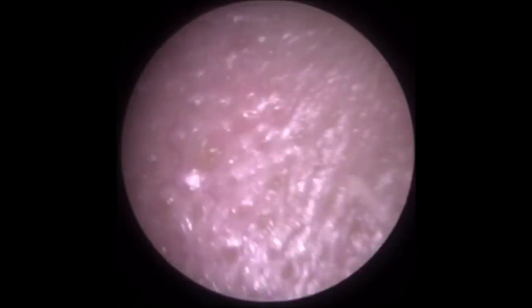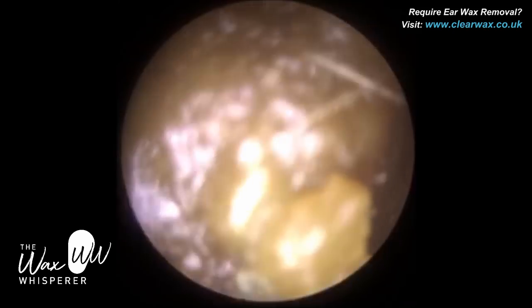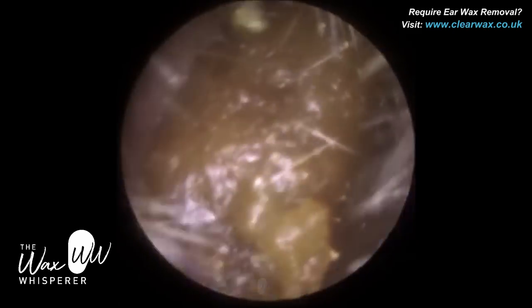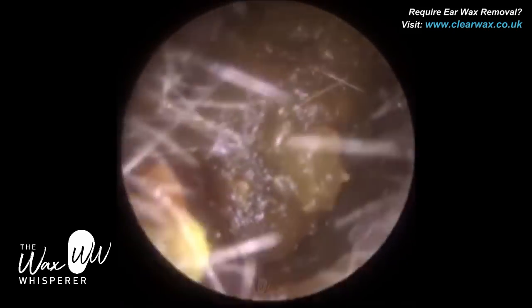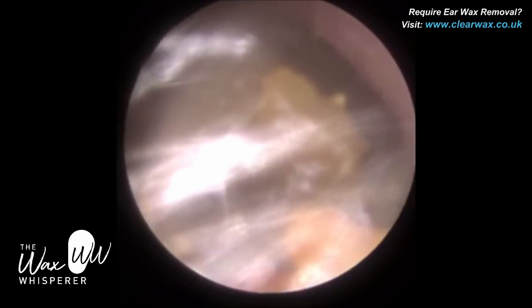The patient in this procedure attended with occluding ear wax in both ears. This is a pre-procedure examination of the right ear. You can see the wax is fully occluding, so it's completely sealing the ear canal all the way around the perimeter of the canal wall.